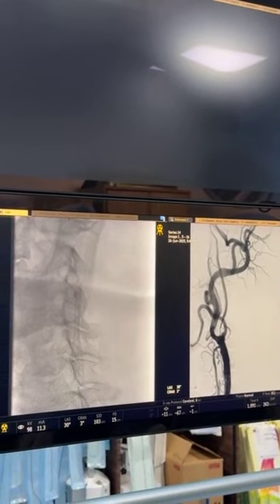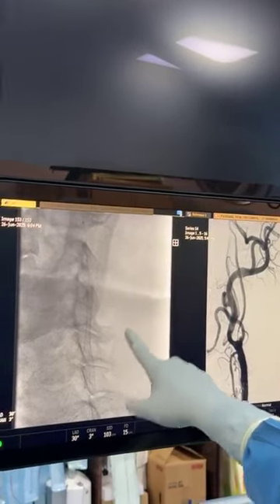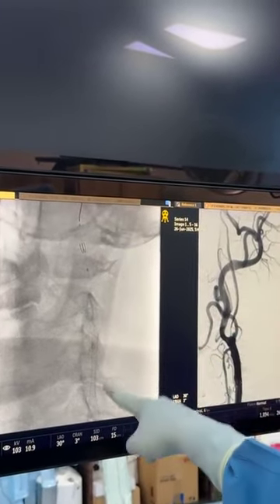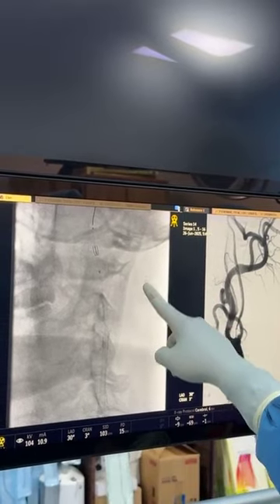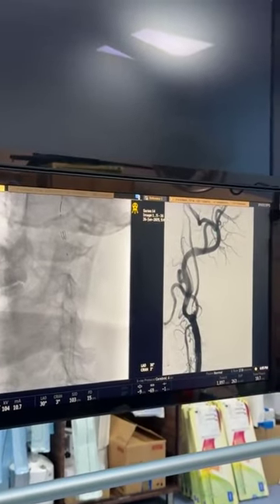The stent is there, the distal embolic protection is there, which we will show you. Prasad, can you show the distal embolic protection? You can see the stent here. So you see the umbrella here. So when we are putting a stent, our distal embolic protection, the filter is there so that any clot, any emboli going from this area will be caught here. So you are giving absolutely good protection.